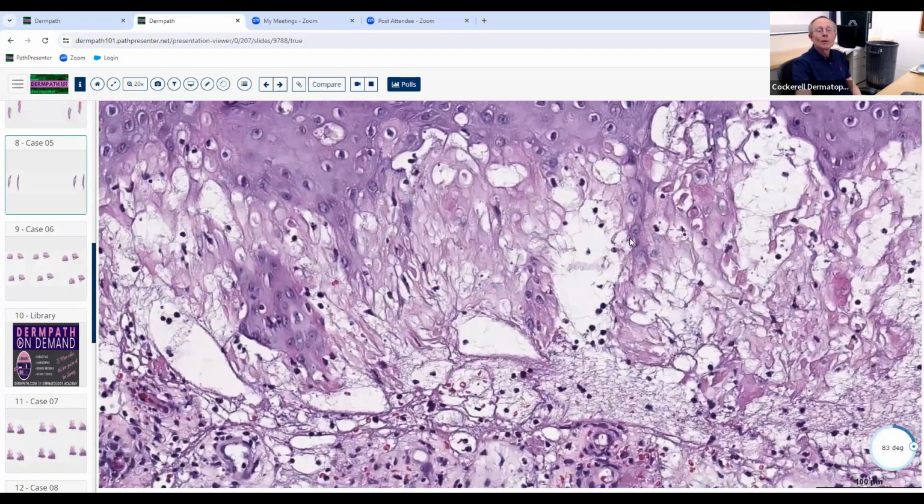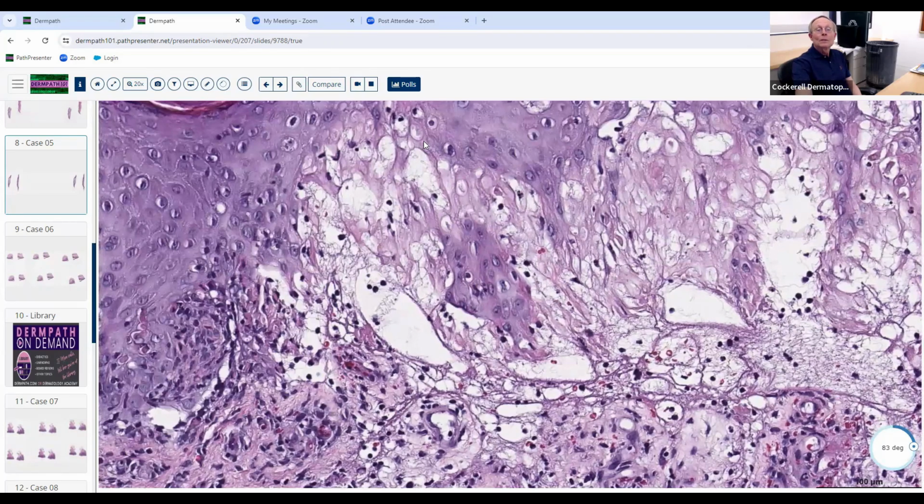And then we've got this other finding here that I want to point out to you, where you've got these little strands of cytoplasm from the keratinocytes here, coupled with the individual collagen strands of the papillary dermis here. You kind of got two strands. You got strands of the epithelium that are kind of being strung out here, like silly putty, if you will, or chewing gum. And then you've got these little strings here that are kind of holding the epidermis up together. So it's almost like the epidermis is crying, please don't let me fly away. And the papillary dermis is saying, well, I'm trying to hold on to you. I'm trying to not let you float off into the distance or whatever.